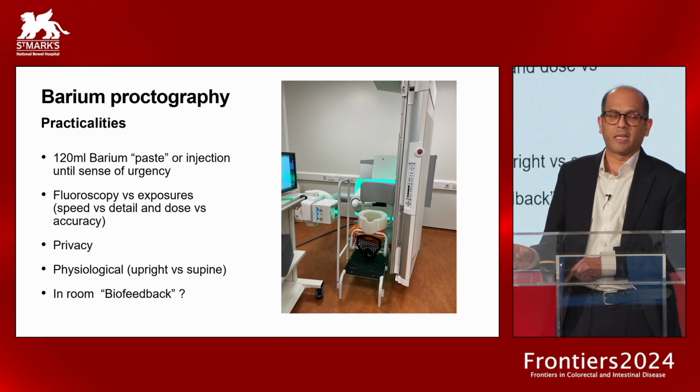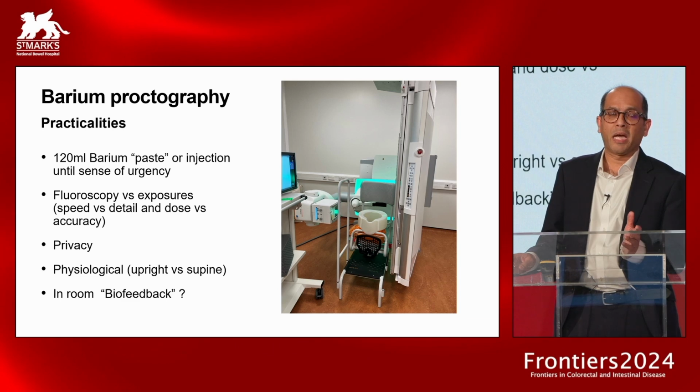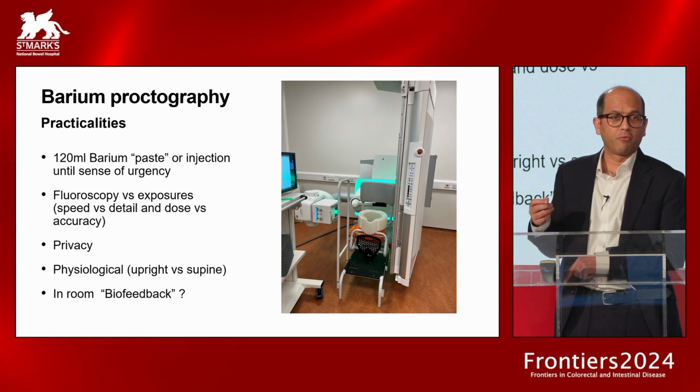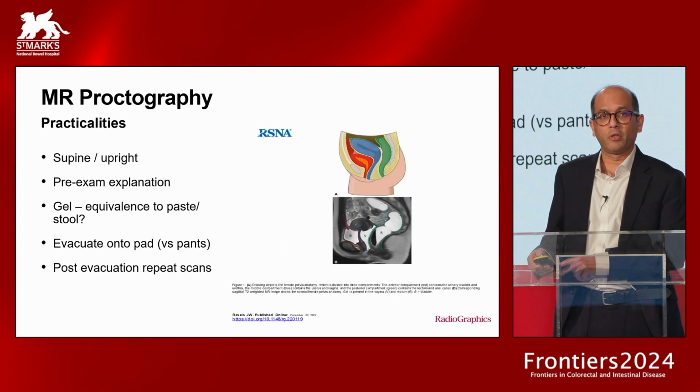One of the interesting things that I just thought I'd touch on, because it's a matter of the practicalities of how our room setup has been created when we recently moved to a new site: we've now got the possibility, and have actually started looking at what effect it has, that the patient is able to look at the screen at the same time as they're emptying, and this may have a potential role in education and almost a form of biofeedback. So we're currently discussing that with the biofeedback team, how that may be quite useful for the patient to see in real time.